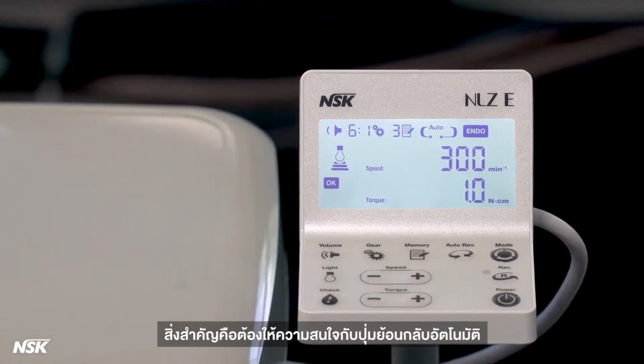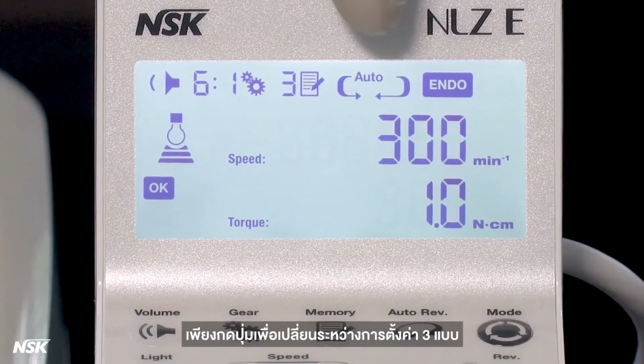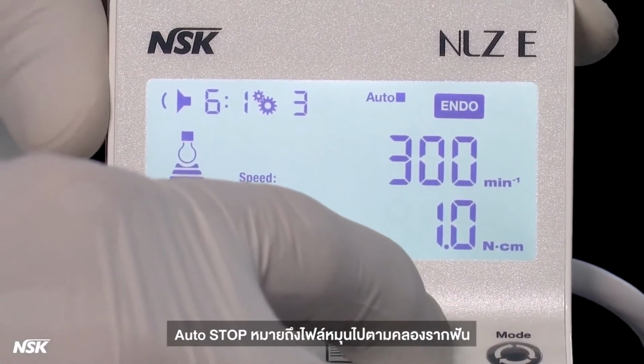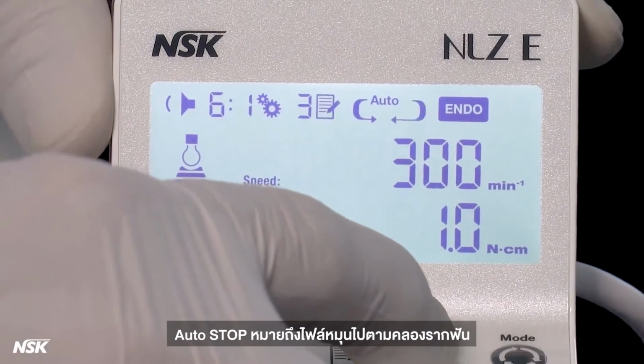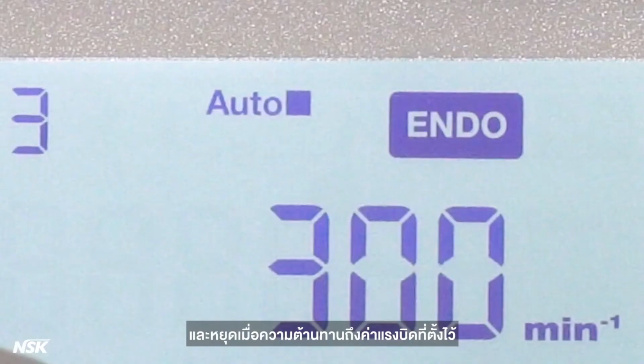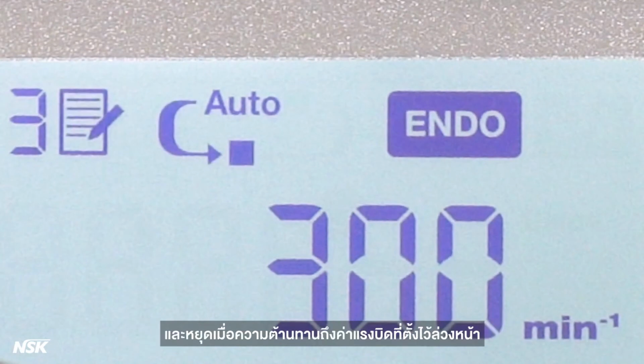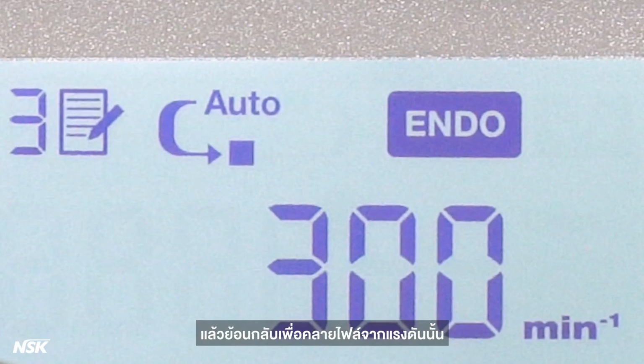It's important to pay attention to the auto reverse button. Simply press the button to change between the 3 settings: auto stop, auto reverse stop, auto reverse forward. Auto stop means the file rotates down the canal and stops when the resistance reaches the preset torque value. Auto reverse stop means the file rotates down the canal and stops when the resistance reaches the preset torque value and then reverses to release the file from that pressure.